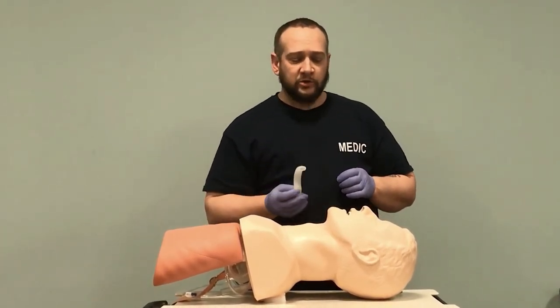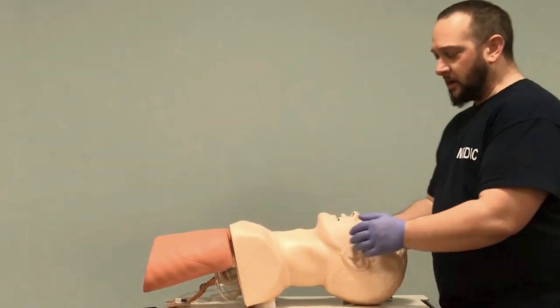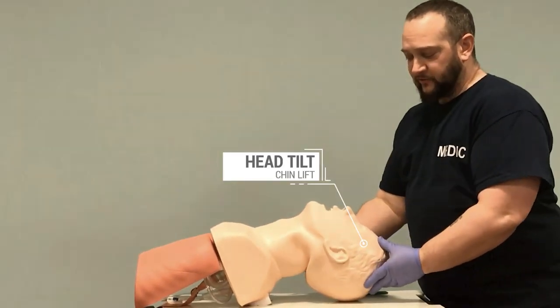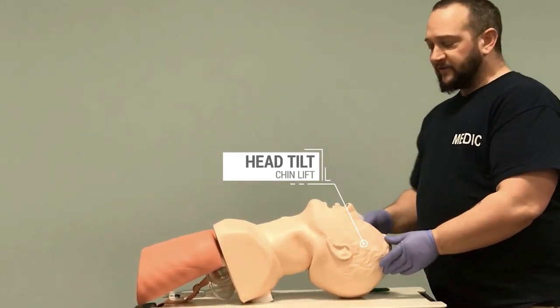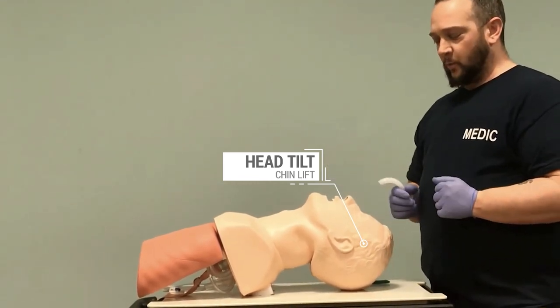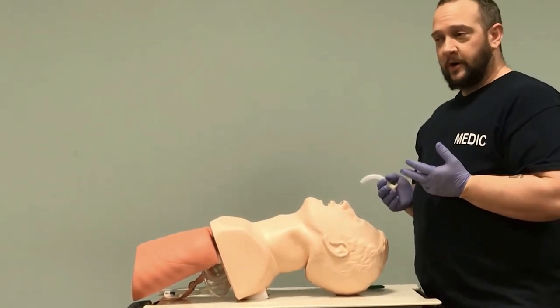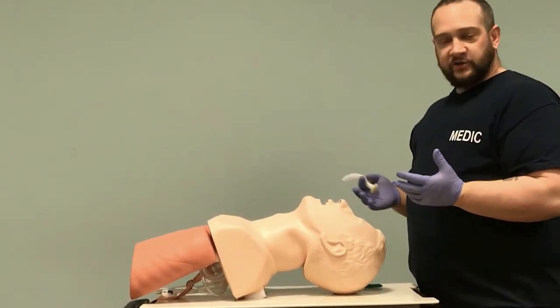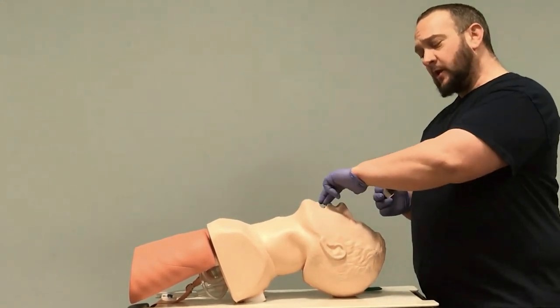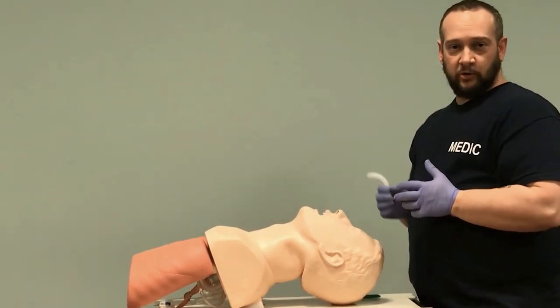When inserting the OPA, you'll be positioned at the top of the patient's head at the airway. After performing a head-tilt chin-lift to open the airway, you need to open the mouth. One option is the scissor technique, discussed in your textbook. However, sliding your fingers risks running them over the patient's teeth, which could be chipped, damaged, or broken — creating an exposure risk for you.